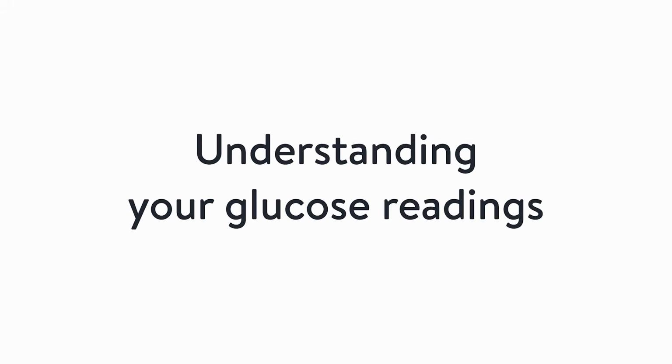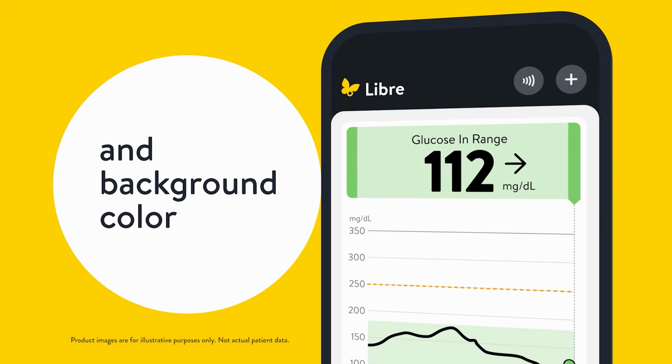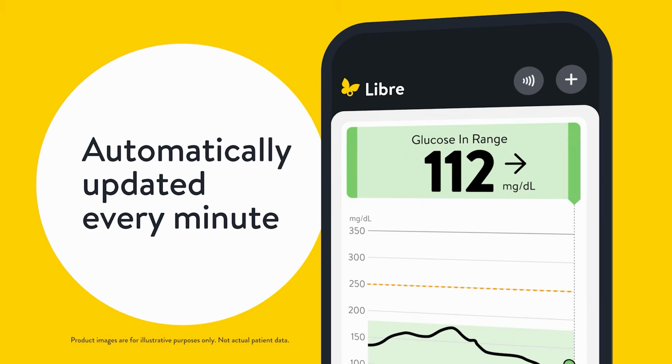Now we'll dive into understanding your glucose readings. Remember, glucose readings appear here, along with your trend arrow and background color, and are automatically updated every minute.